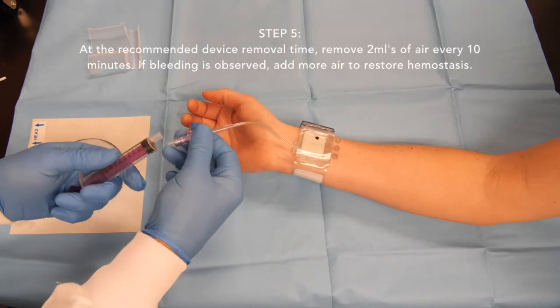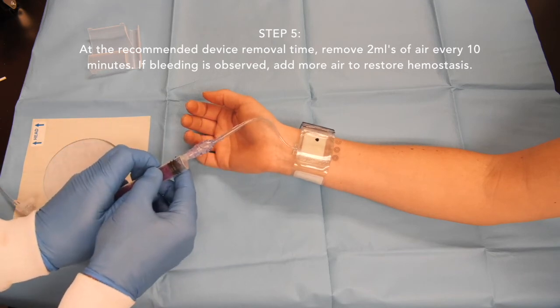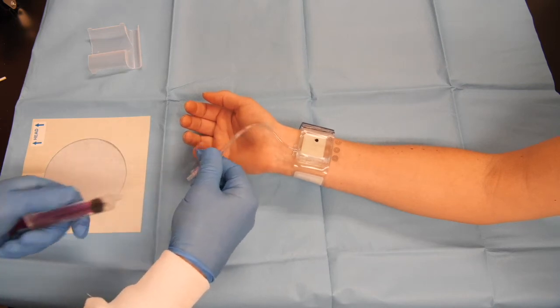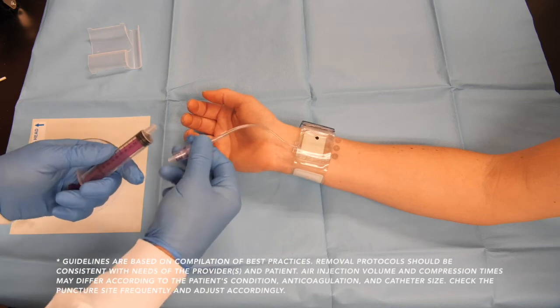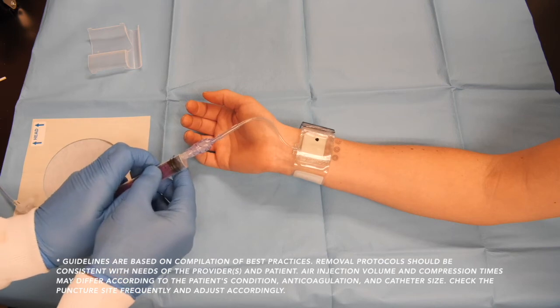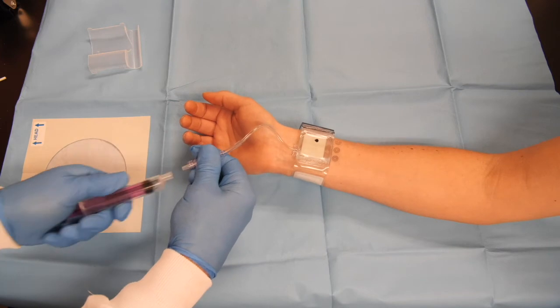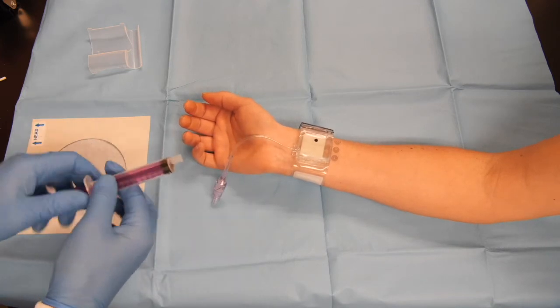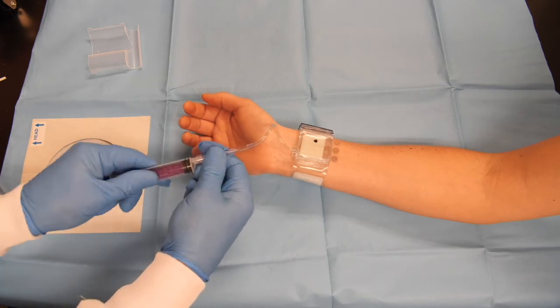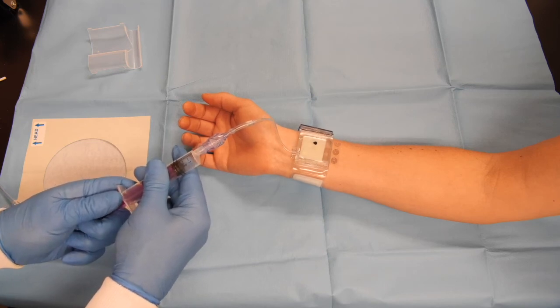At the targeted device removal time, use the air syringe to gradually remove air from the balloon in 2 ml volume removal steps. If bleeding is observed, stop the volume removal and add back 2 ml of air volume in a stepwise fashion into the balloon to restore hemostasis.